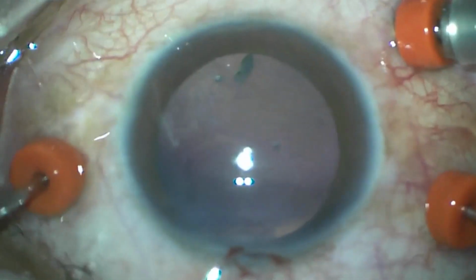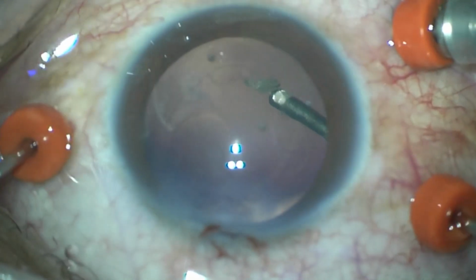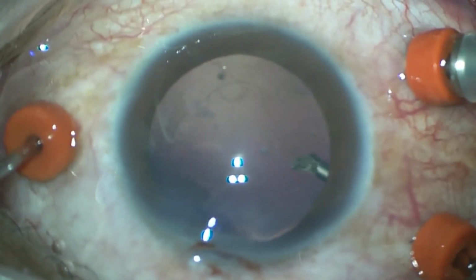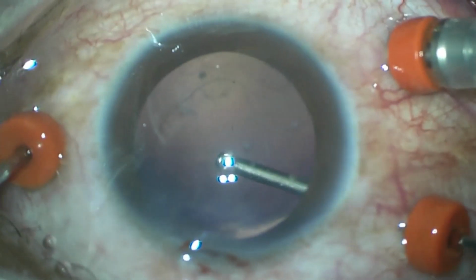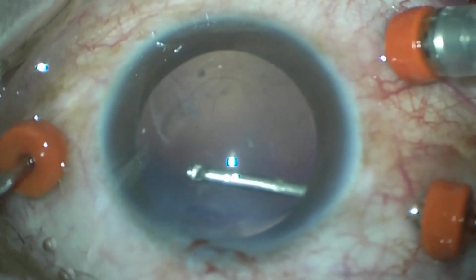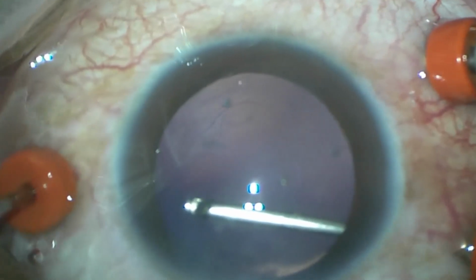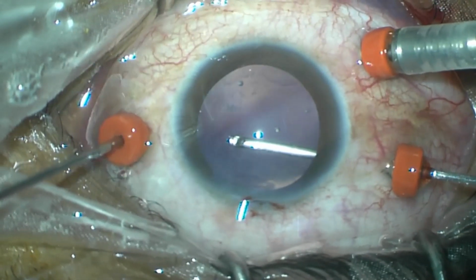So at this moment, this foreign body can be seen suspended here. I have brought in a vitrectomy cutter which has pulled in the foreign body and is trimming the vitreous fibers around it. And luckily the foreign body got trapped into the cutter port, which made it so easy for me to remove it. Now the foreign body is firmly secured in the cutter port, and now we can go ahead and use a foreign body forceps to engage this foreign body and remove it from the eye through the posterior capsule and the limbal incision.